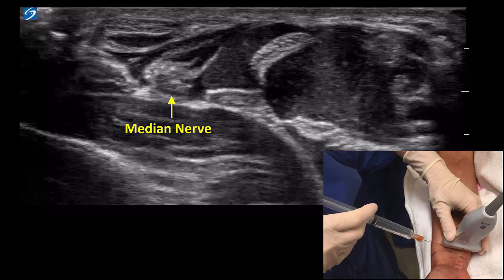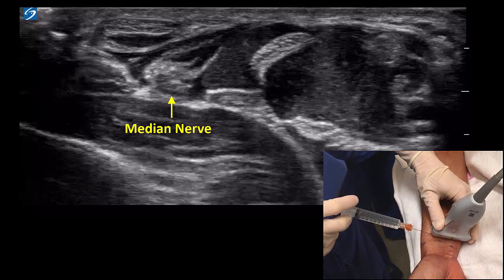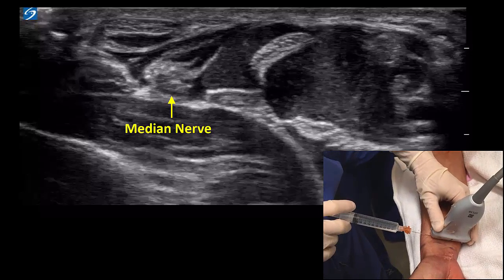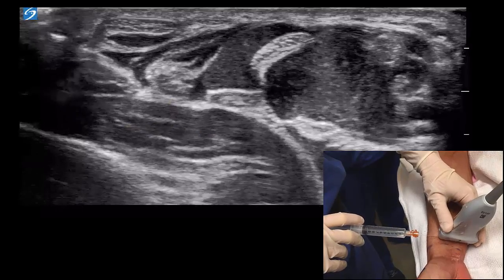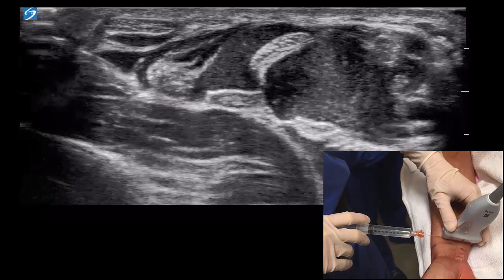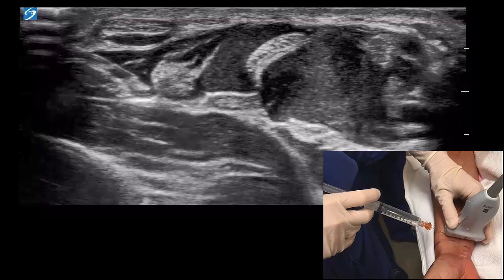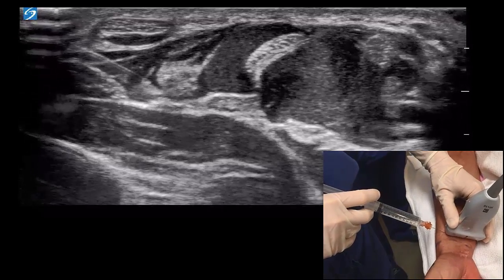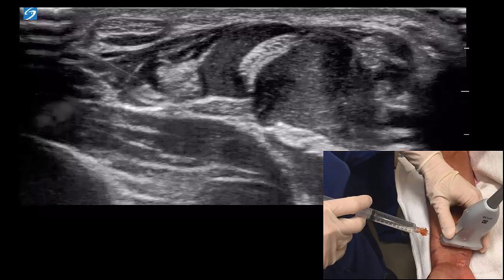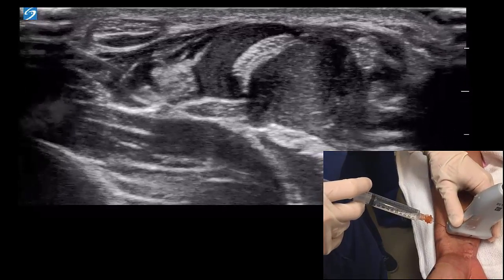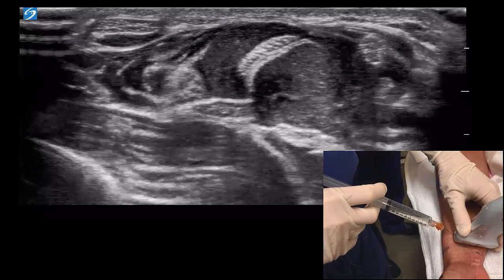In this video the median nerve is targeted at a more distal location. More experienced practitioners can use a single-operator technique with a 25-gauge hypodermic needle. The aim is to inject within the fascial sheath with minimal needle-nerve contact. Needle repositioning is not usually needed if local anesthetic is spreading within the sheath.